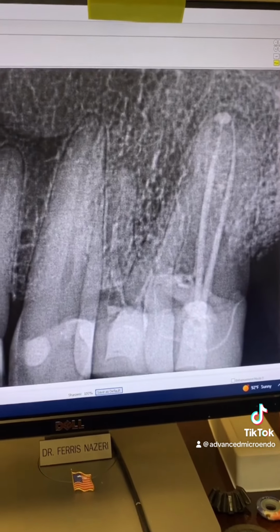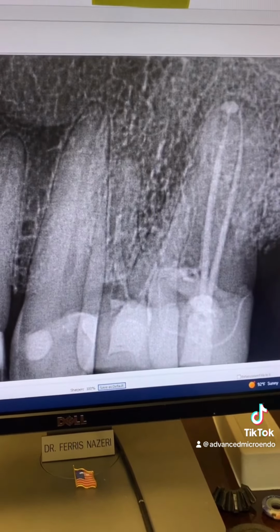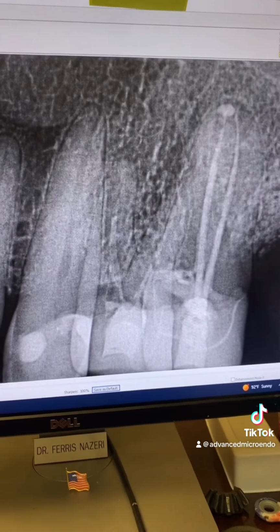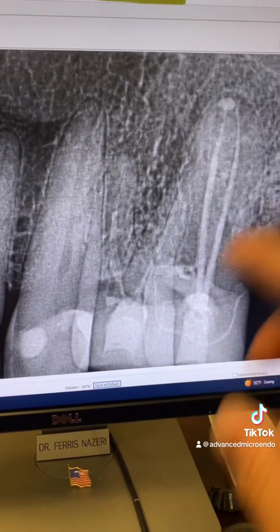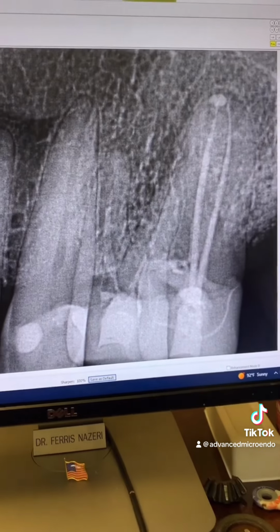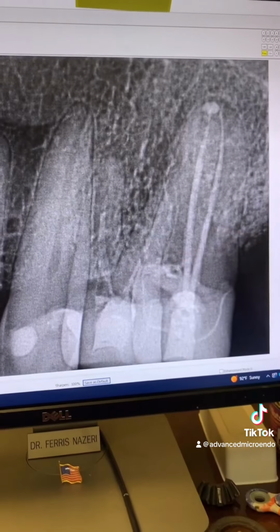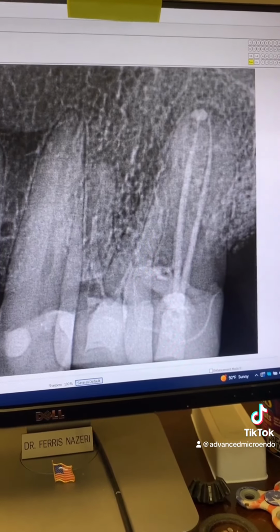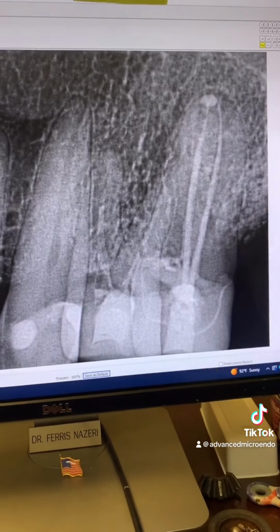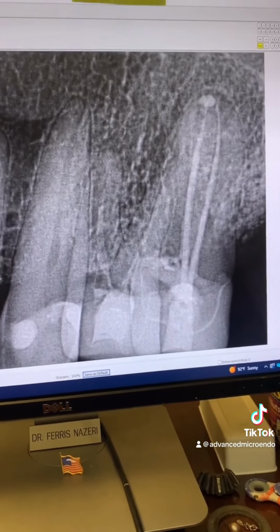You don't use a rubber dam. You don't use 5-6% sodium hypochlorite. You don't irrigate enough. You don't recapitulate. You just want to go straight to obturation and create those pretty white lines on an x-ray. Again, pretty white lines don't mean anything if you didn't adhere to the steps before creating them. And you can see this is an example right there. Okay, so obturation is important, but so are the steps that you have to take before the obturation part.